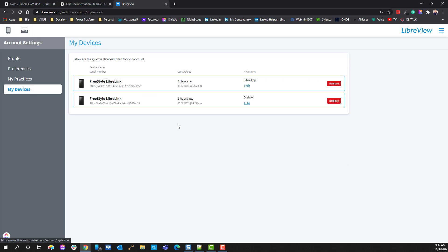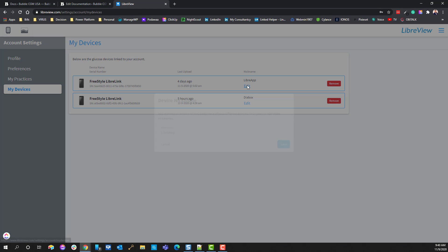The other thing that you'll have to take notice here is my devices. So if you have a Freestyle LibreLink application on your device, in addition to the Diabox application, you're going to wind up with two devices potentially that could send information up to this particular account. And so it's very helpful to go ahead and edit this.